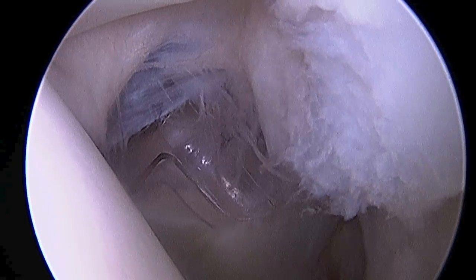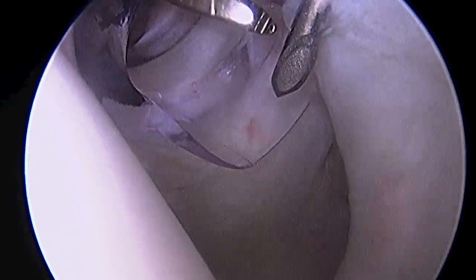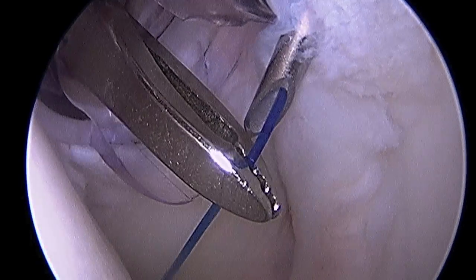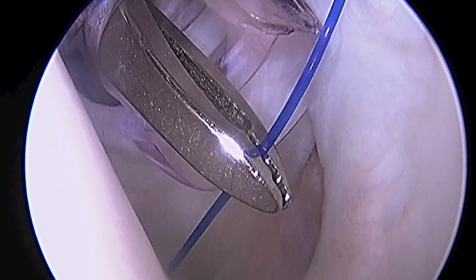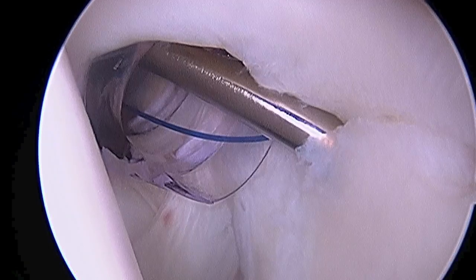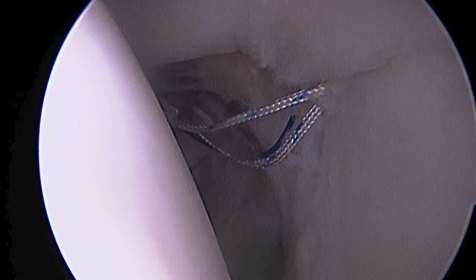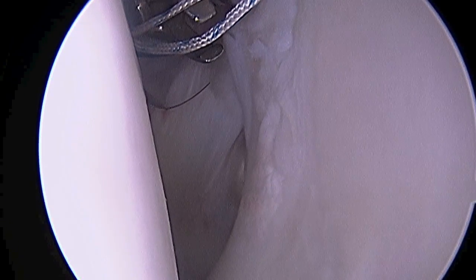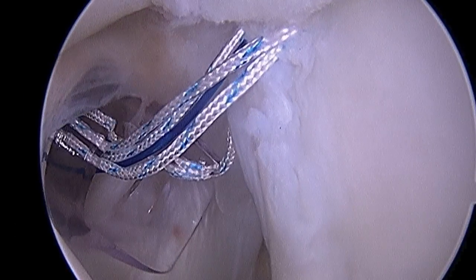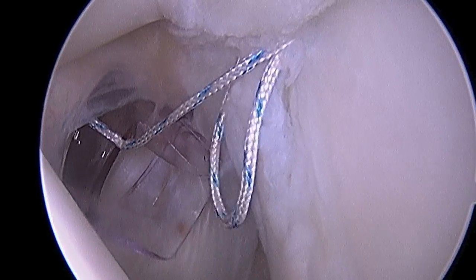Now what you're looking at is a spinal needle coming through the superior labrum. We've picked out a spot where we want to place a stitch. The first stitch is just a smooth traction stitch. You can see as it comes through the needle and my assistant retrieves it out the anterior portal. That's going to allow us to mobilize the labrum so that I can place an anchor. There you see the guide for the anchor coming into place. Then we drill the bone and impact a suture anchor into the bone at the top of the cup of the shoulder. We then use that previously placed suture to pass one arm of the suture anchor stitches through the anterior portion of this superior labral tear. There you see the first stitch of our repair going into position.